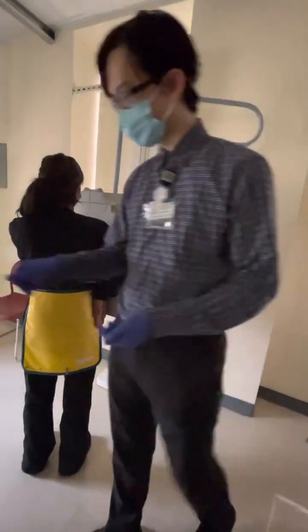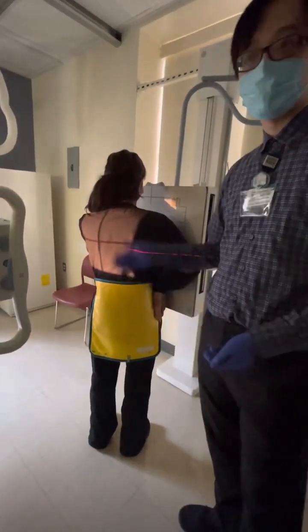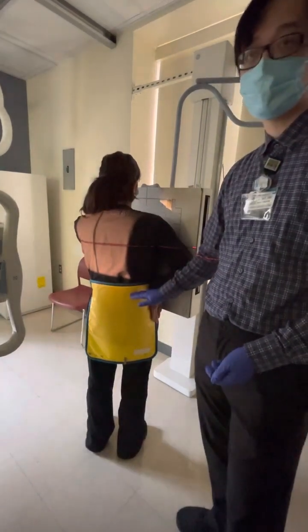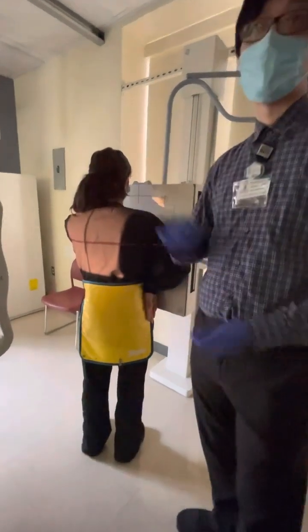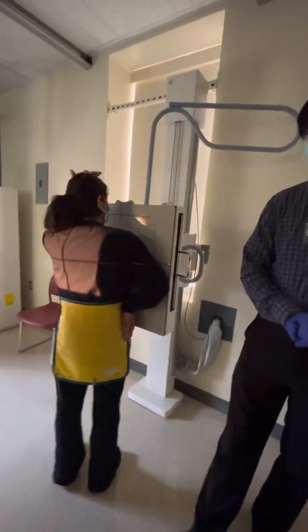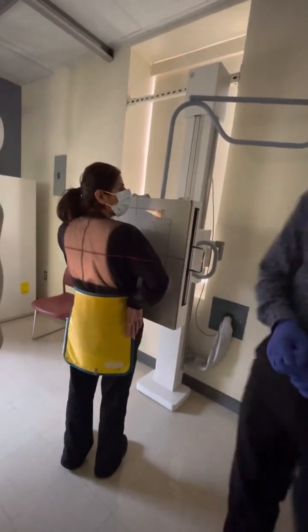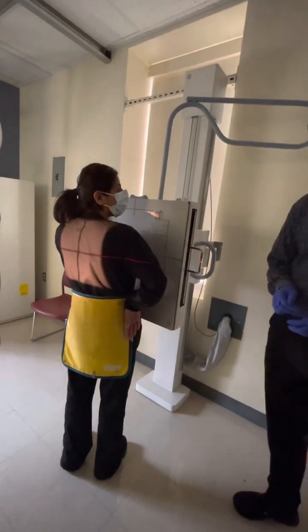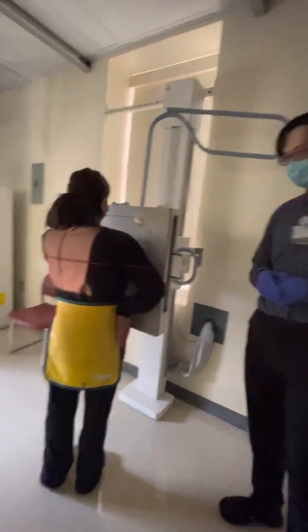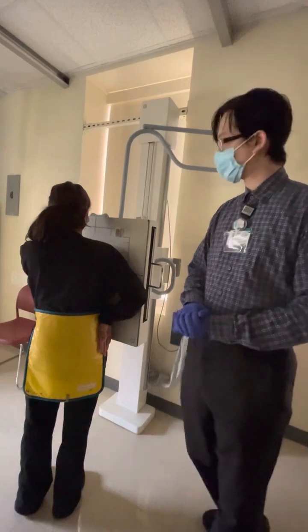For lower ribs, we basically do the same thing we did last time. Just take this, drop it down to about the level of the iliac crest, or just a tiny bit lower, and then do it on expiration when they breathe out. Do that for anterior ribs, even obliques? So yes, on obliques you do lowers, and the reason is because now we're not just looking at the front, but also the side. So that's why we do lower obliques. Okay, any questions about that?